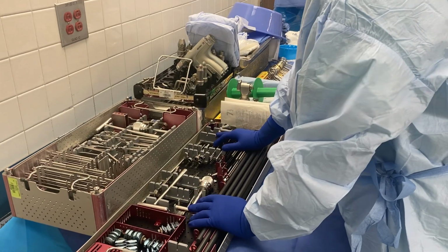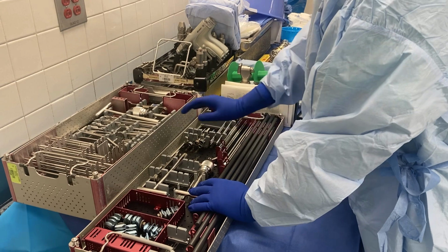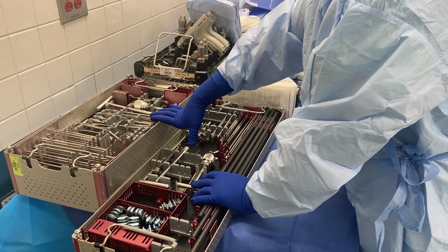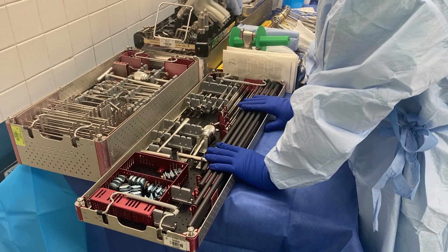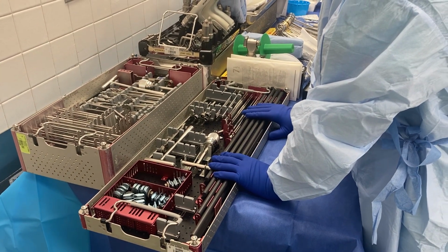All right, so today we're just putting on an X-Fix on our patient. I've opened the Synthes large external fixator tray, and the doctor has asked that we do a spanning X-Fix. So I also opened the long X-Fix tray. A spanning X-Fix just means that we are going to be crossing the knee.